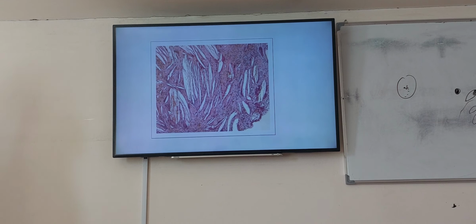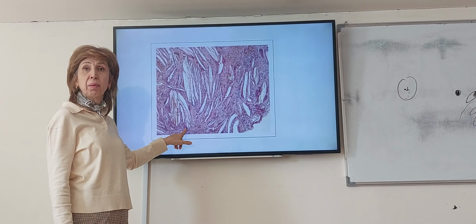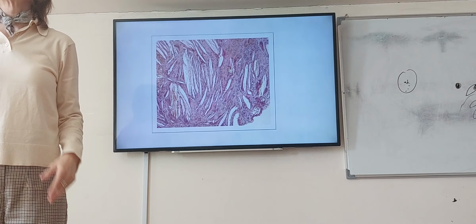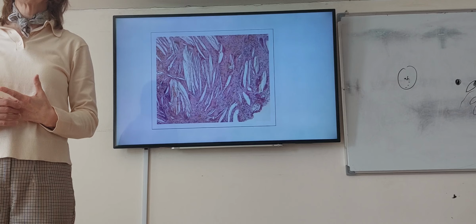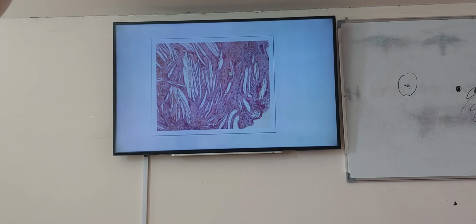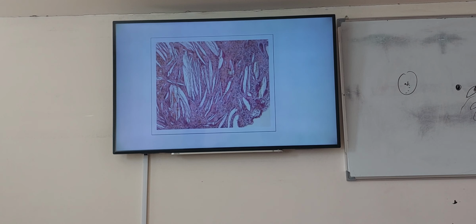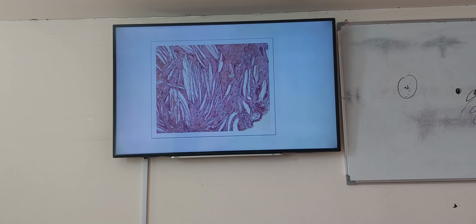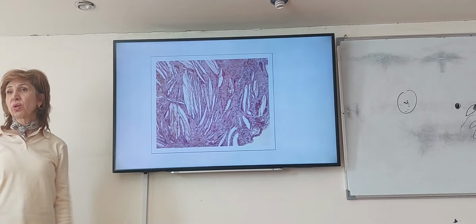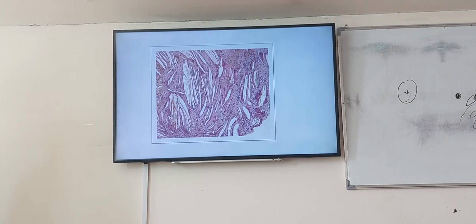Cholesterol, what do I see? This is foreign body. Yes? Foreign body is cholesterol. What will I see? Multinucleated giant cells of foreign body type. Plus, you know this now. Remember. Which cells? I will not say. Remember. Foam cells. Because I see cholesterol in macrophages, and macrophages are called foam cells. Okay? Once you see foreign body granuloma for cholesterol, I will see multinucleated giant cells, foreign body type, plus foam cells.